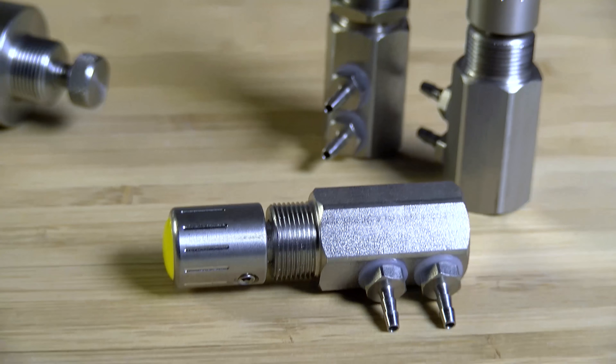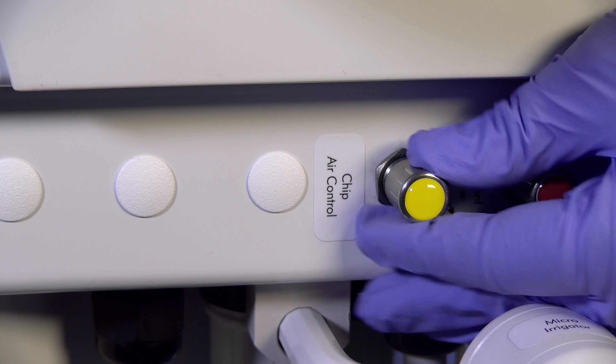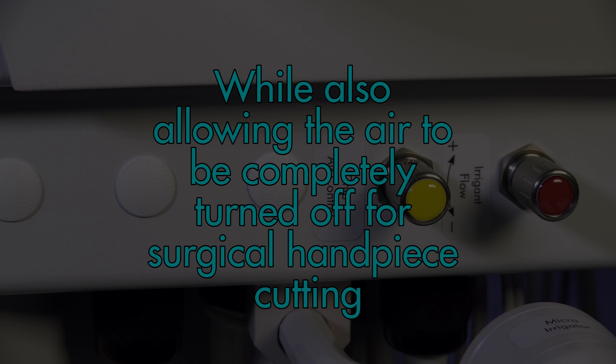The stainless flow valves for water spray feature very fine threading to allow feathering control of water coolant from fog to spray. The chip air control can also be adjusted to increase handpiece coolant atomization while also allowing the air to be completely turned off for surgical handpiece cutting.